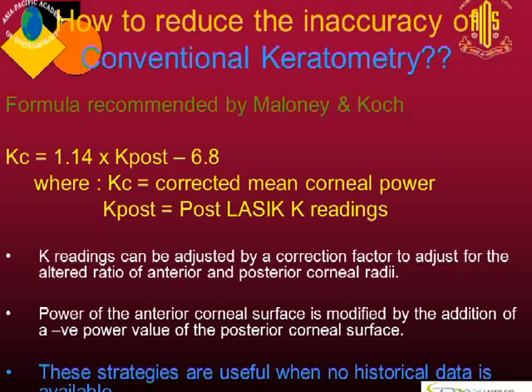The K readings can be adjusted by a correction factor to adjust for the altered ratio of anterior and posterior corneal radius of curvature. Now these strategies are useful when no historical data is available.